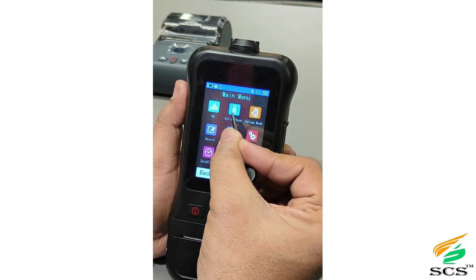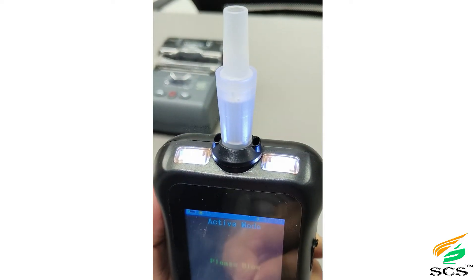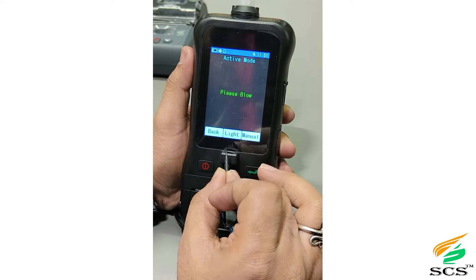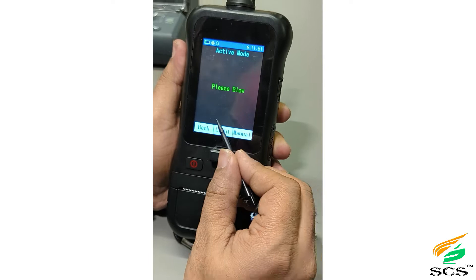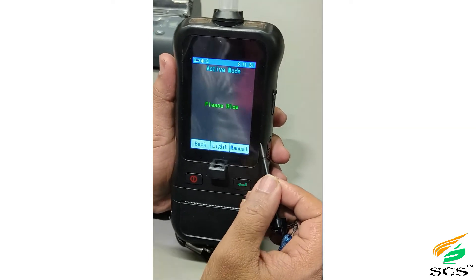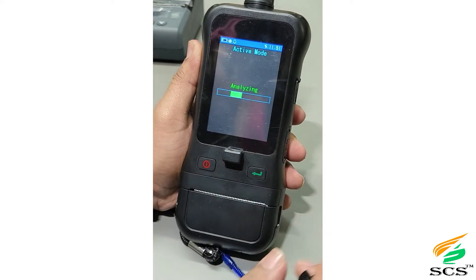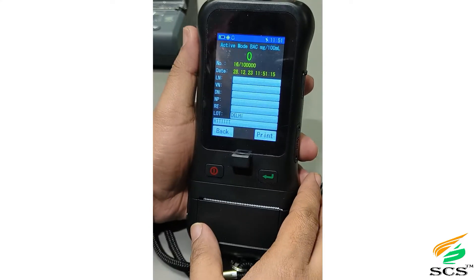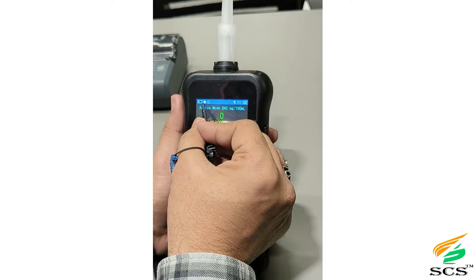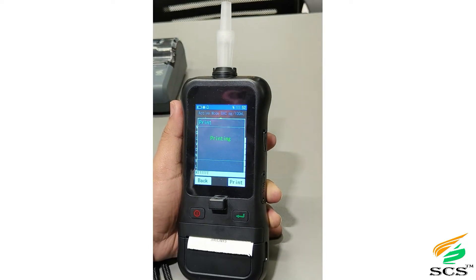For the active test, put the mouthpiece on the device and click the flashlight button to turn on the flashlight — this is useful at night. When the flashlight is on and aimed at a face, the camera captures a picture. If you click Manual, it will take a manual test without any blow. A form will appear in which all information has to be filled. You can store up to one lakh records; clicking Print will print the receipt.